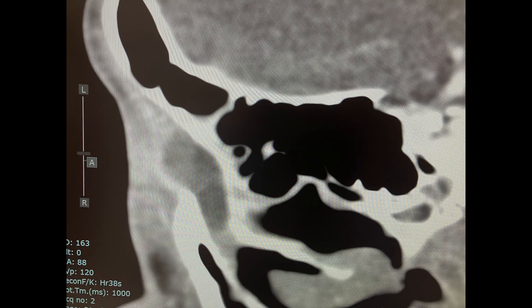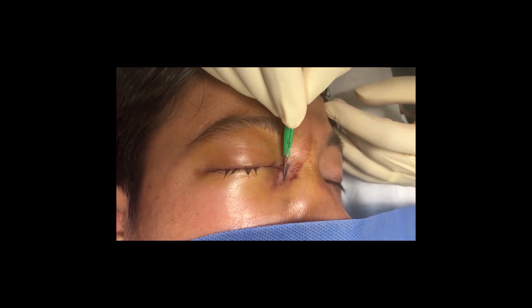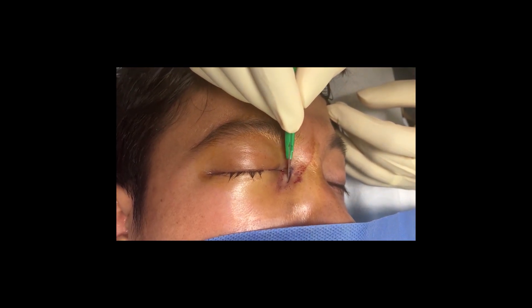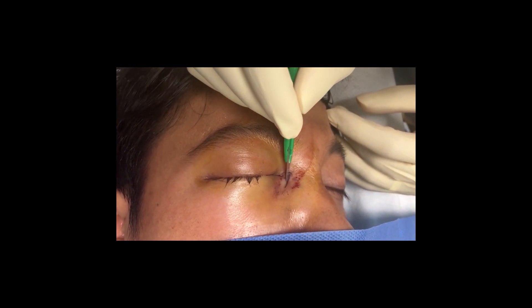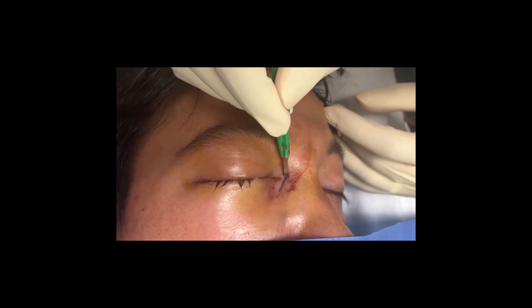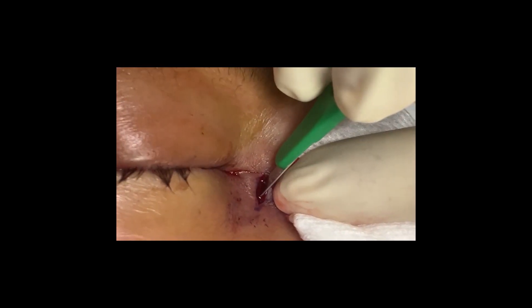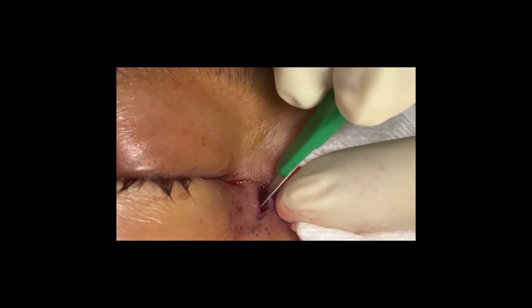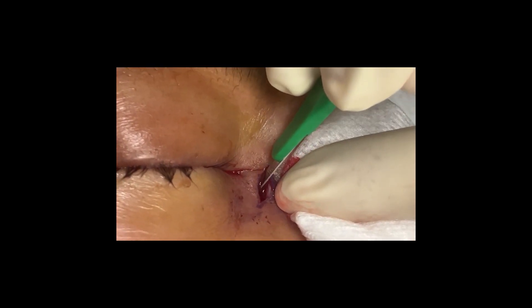The area is anesthetized, which can sometimes be difficult due to the tight skin from the abscess. You don't want to anesthetize directly into the sac but around it. A 15 blade is then used to make an incision over the sac.